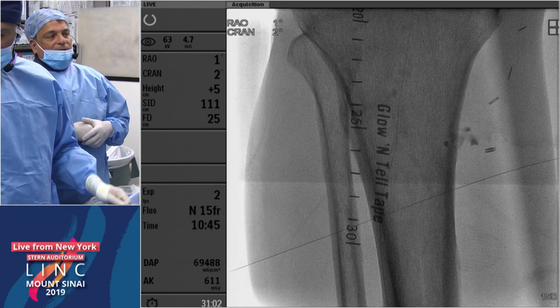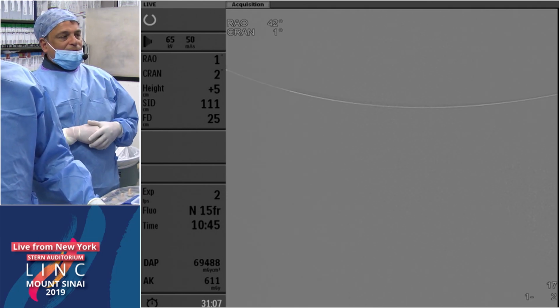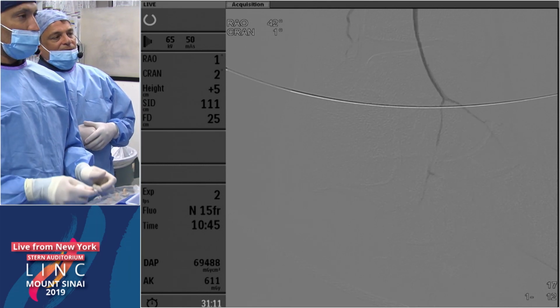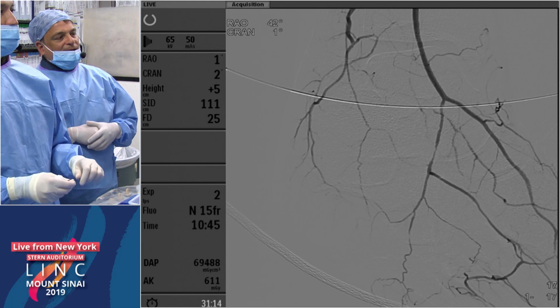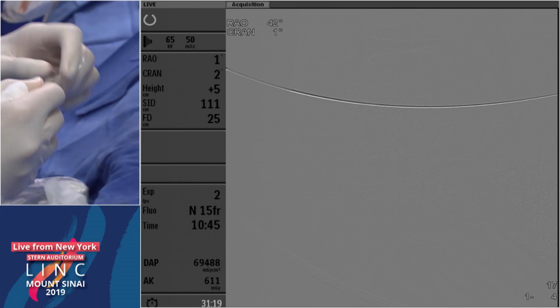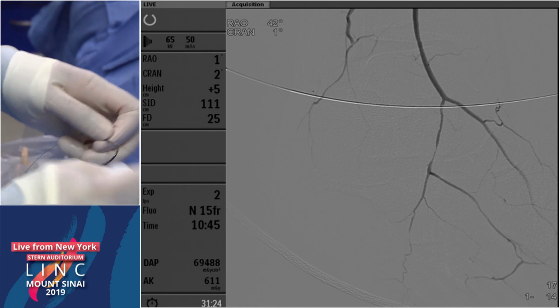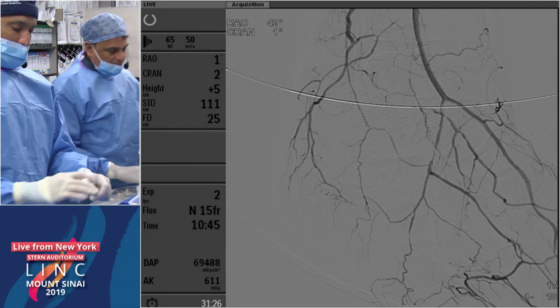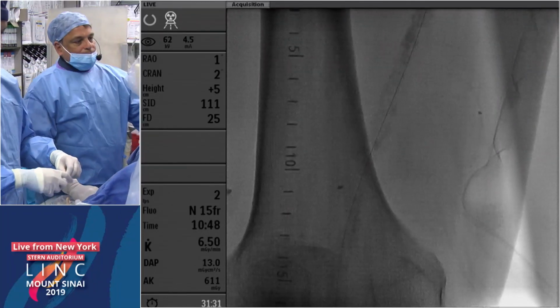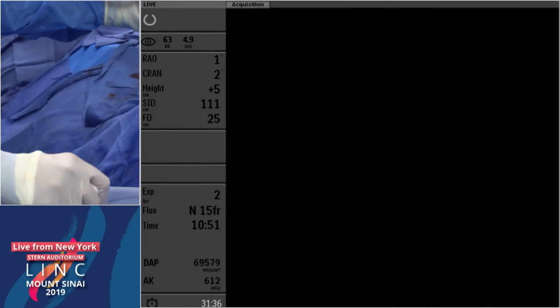Can you show the heel shot, please? So if you see the heel shot, I'm curious on their opinions in terms of whether you think opening the peroneal, the popliteal, will help this heel ulcer get better, because he has robust flow through the posterior communicating branch, and it looks like the heel is filling at this stage. So any of the panelists want to talk about angiosomes, or if you want to comment about whether you think that revascularization of a specific segment is of value.